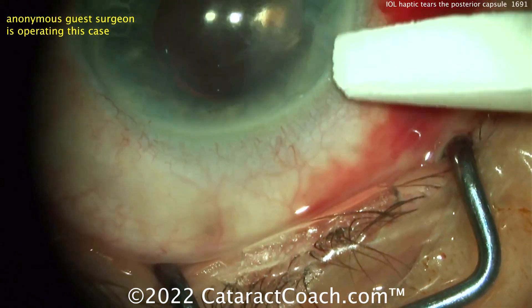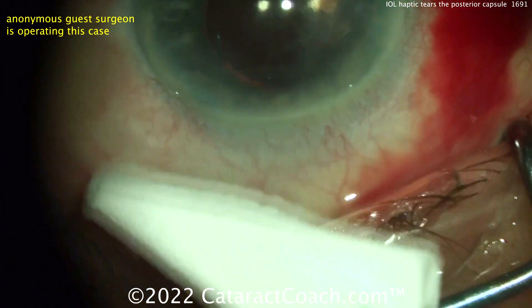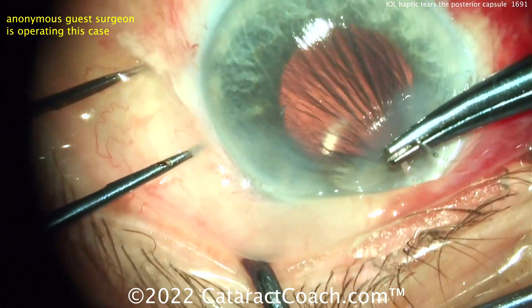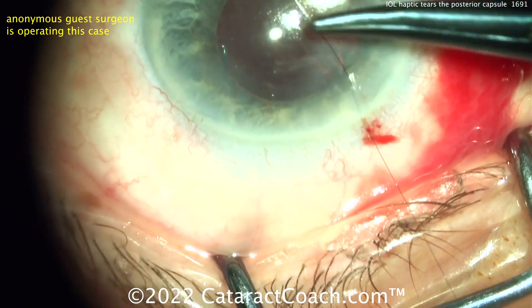At this point you probably want to put in some triamcinolone to check the incision — you can see if there's any vitreous prolapse and see if it tends to move the iris; if it does, you may have to do a vitrectomy. A suture is going in — I definitely think a suture is a good idea in a case like this where you have a suspected issue.